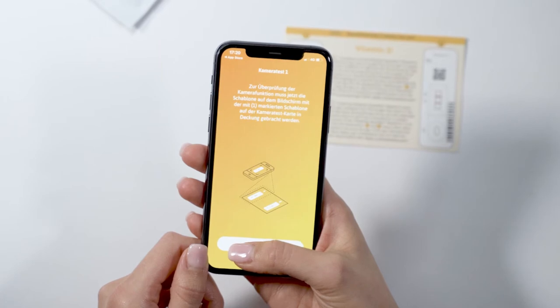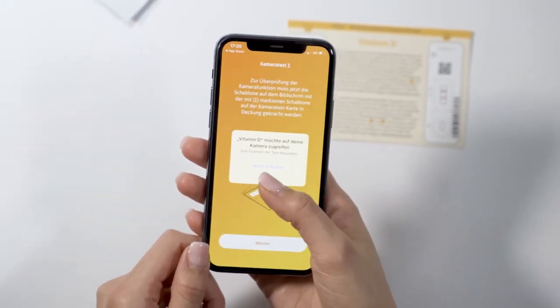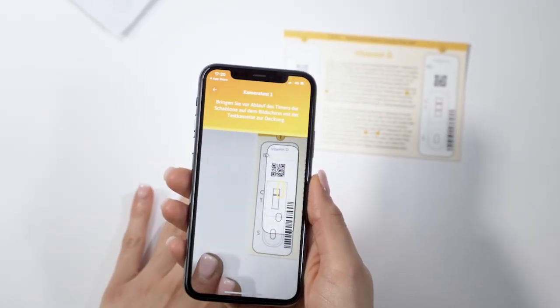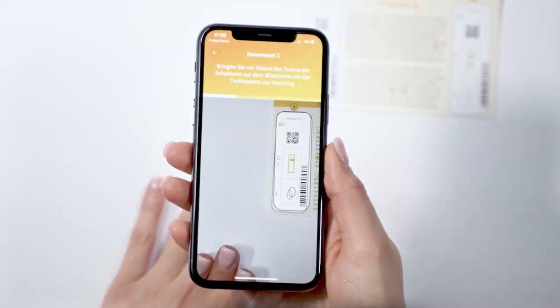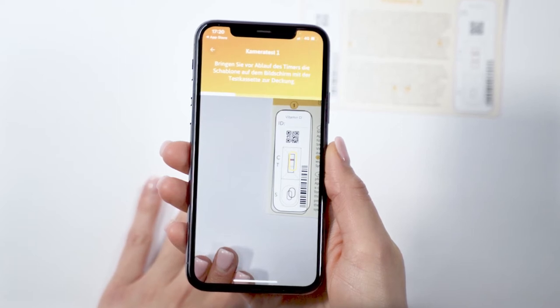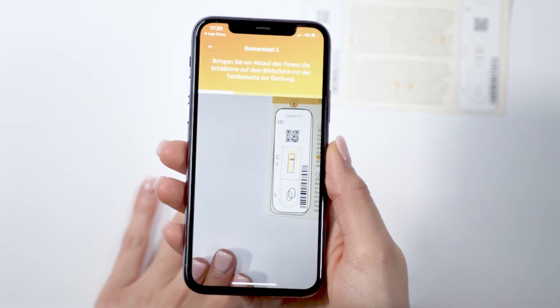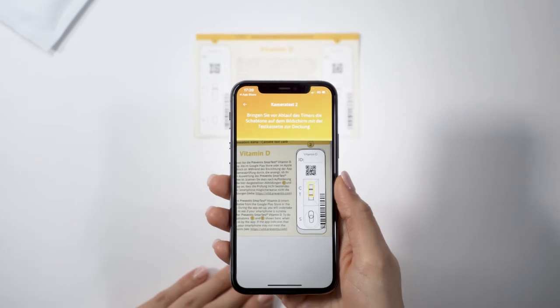To start the camera test, the app automatically activates your smartphone's flash. The camera test consists of two steps. In step one, align the template on your display with the image of test cartridge one on the camera test card. Make sure to hold your smartphone parallel to the camera test card. In step two, repeat this process with the image of test cassette two.